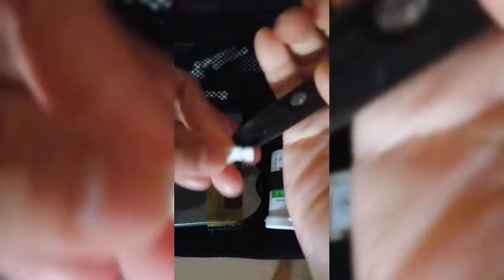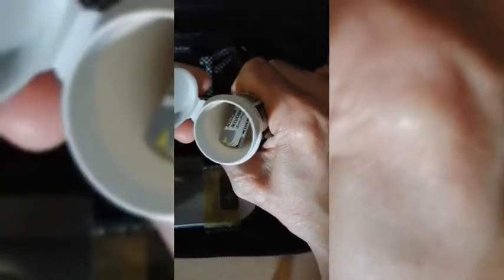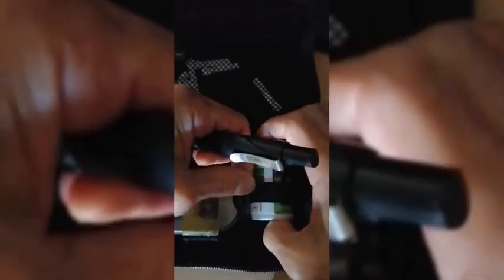And then, when the lancet is inside already, you have to push and it usually turns yellow. Then you prick with this button. And this is the lancet. And this is the strip — ilalagay yung sa yellow na yun, doon ipapatong yung blood sample. Ipapakita ko sa inyo ang actual procedure ng how to take the blood sugar — this is the fastest and the easiest. Makikita natin agad-agad ang results.